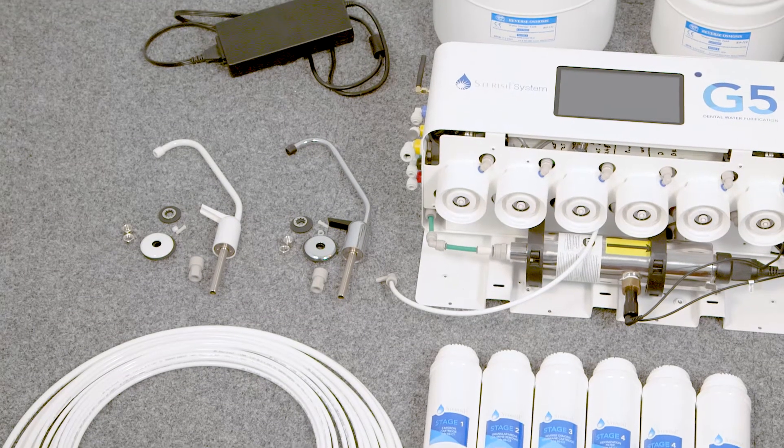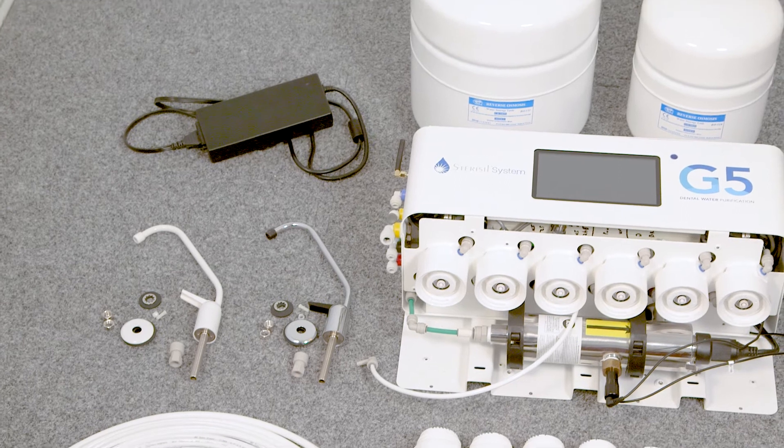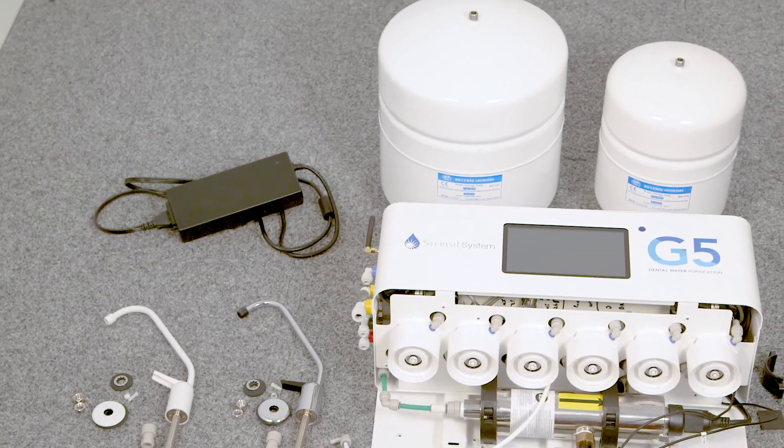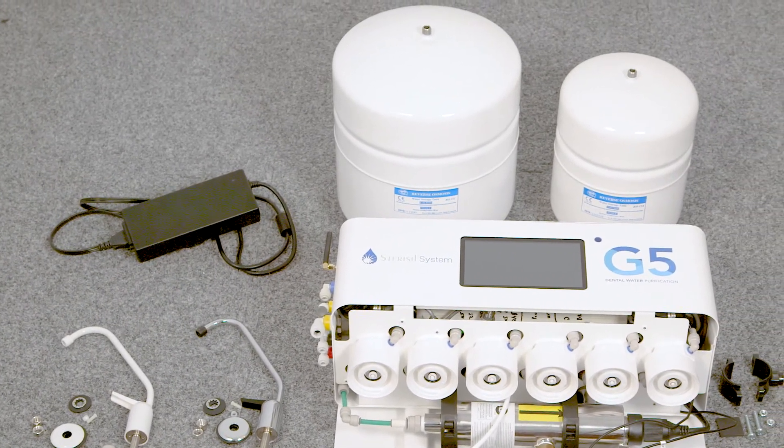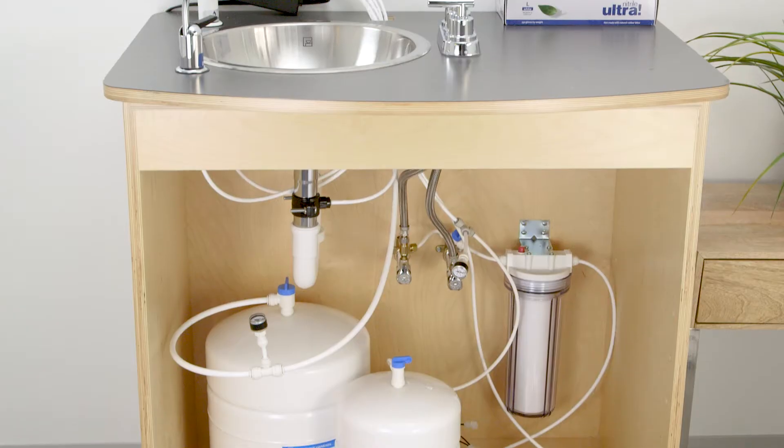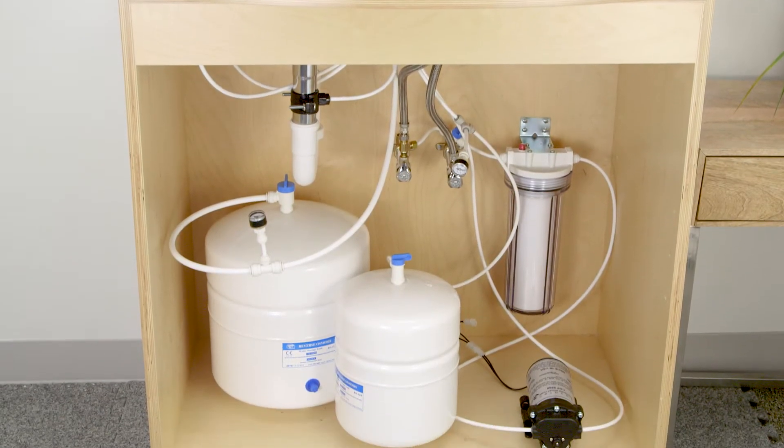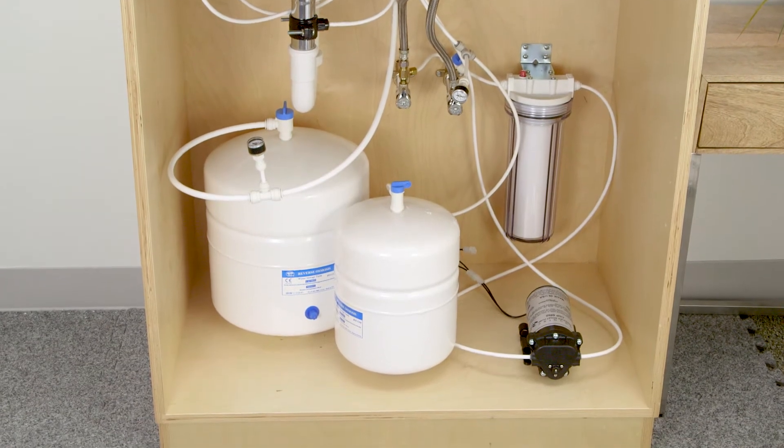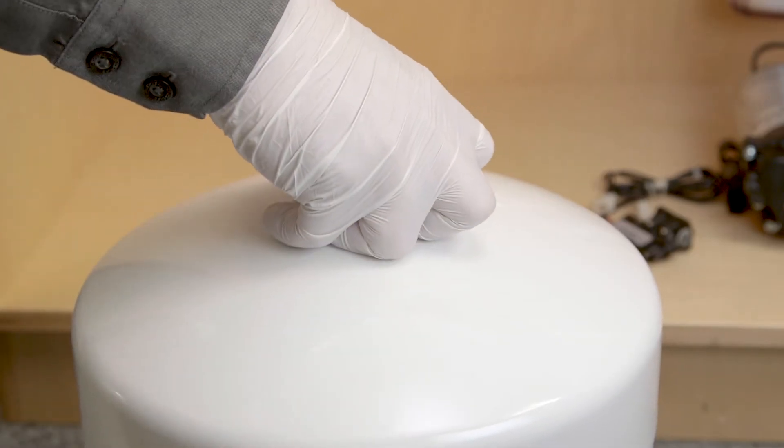Water storage tanks. The standard G5 configuration includes a four gallon reverse osmosis tank and a two gallon dental tank. These sizes may differ with customer specifications and needs. As a default, the RO storage tank will be the larger of the two. Let's start by removing the white cap from the RO tank.